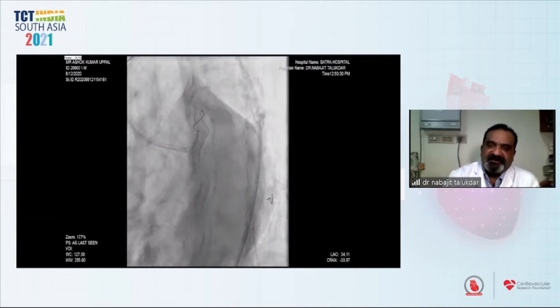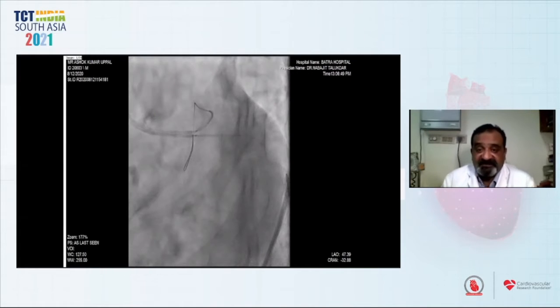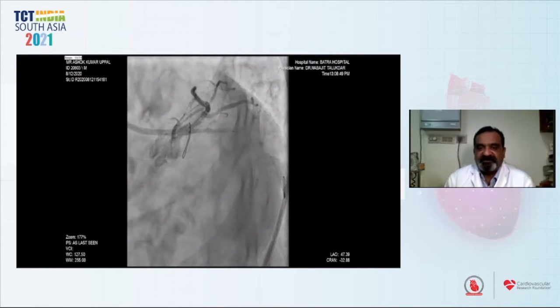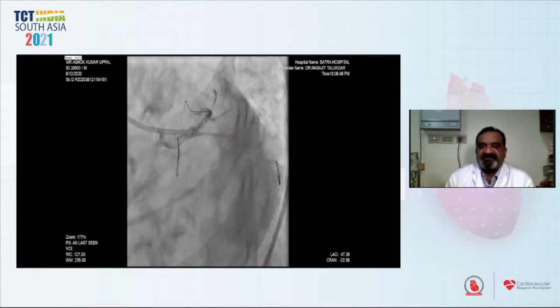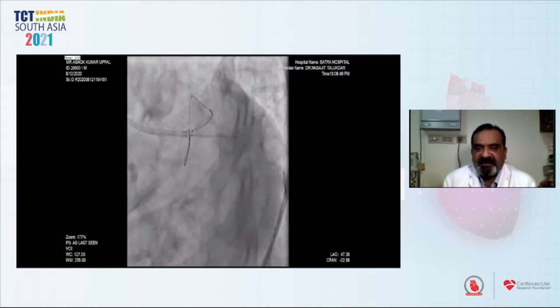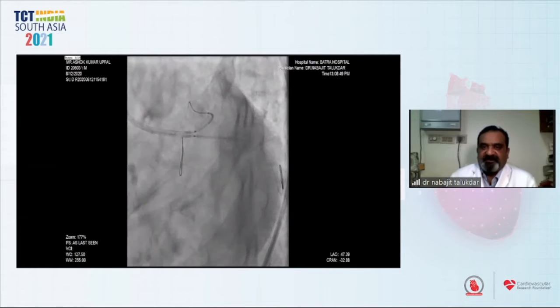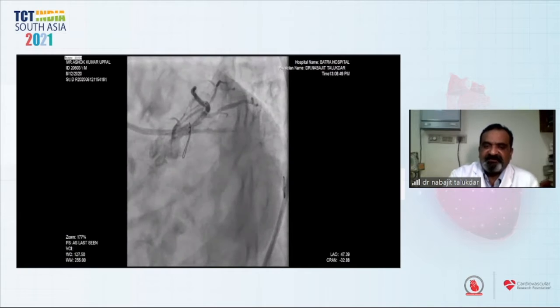We decided to go for V-stenting. Because there was renal dysfunction and the patient was COVID positive, we had to conserve dye and do the procedure efficiently. We placed two stents: 3.5 by 28 mm in the LAD and 3.0 by 26 mm in the circumflex, matching and covering the lesion and taking care not to go deep inside the left main.